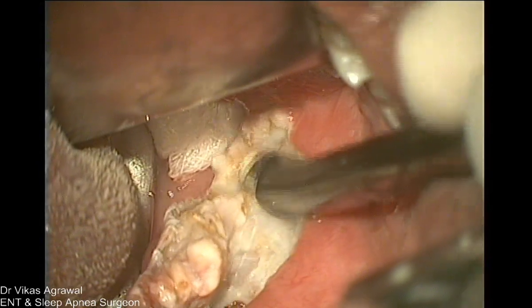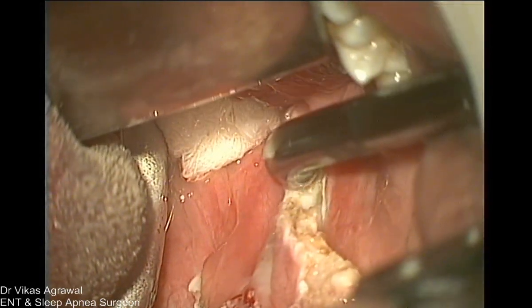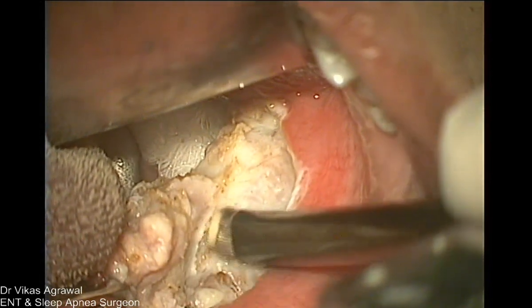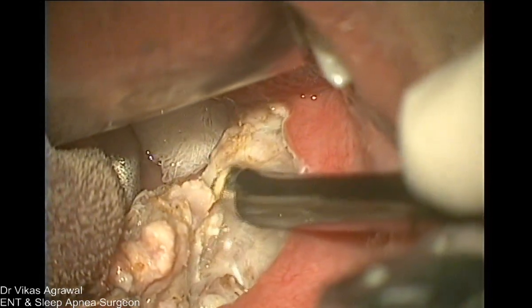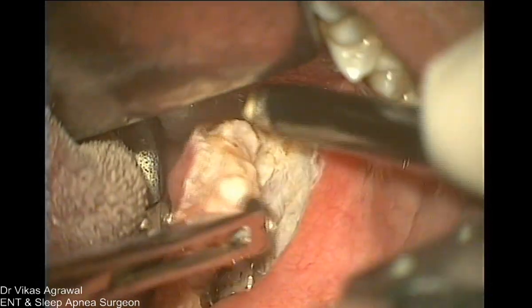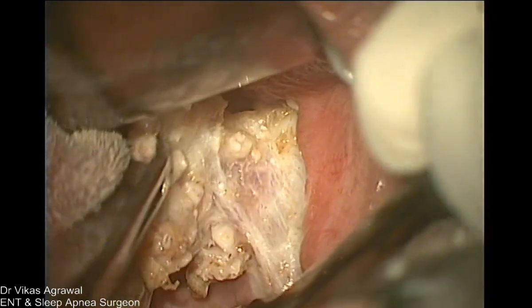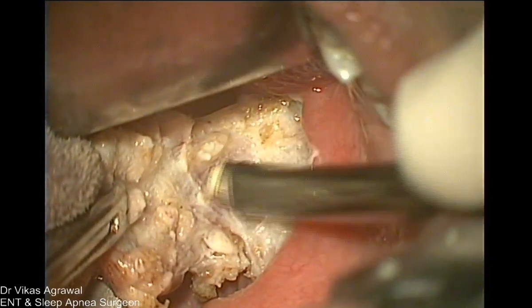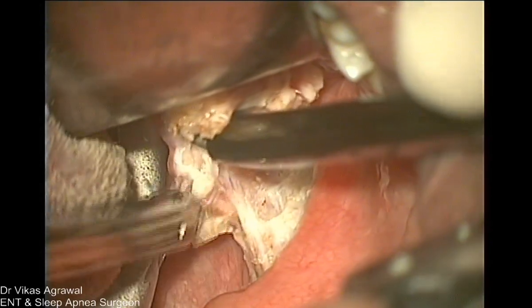I'm just leaving a little bit of tissue over here to protect my tonsillar artery. So see, on table you can tackle whatever is there. But when a patient has gone home and after 7-8 days, if he has a secondary bleeding, right, these are the, can you see the fibers? Yeah, these are very well vertical fibers. These are the oblique fibers. This is the oblique fiber, correct?